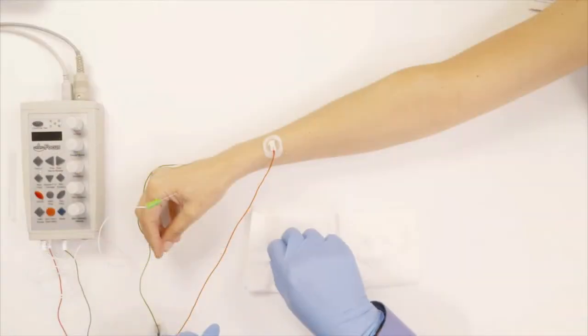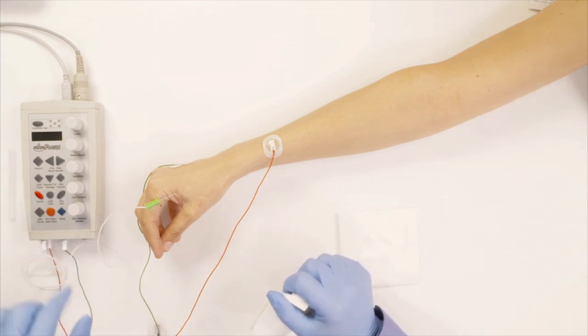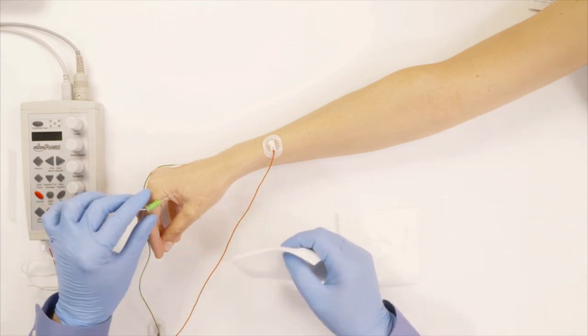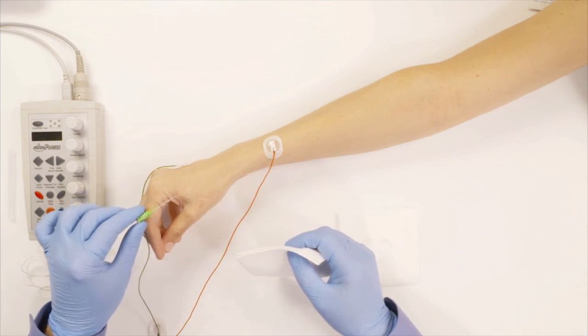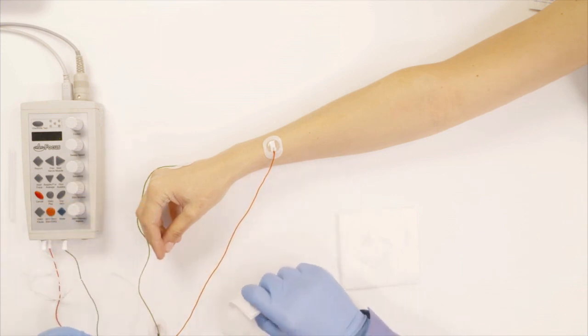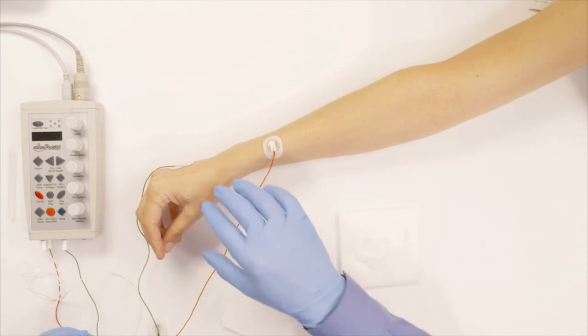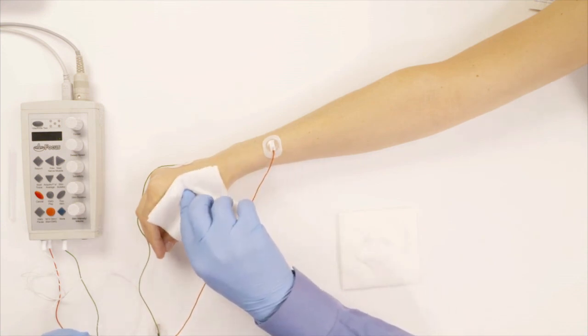So now I will take the needle out. And it's very important at that point that when you're taking the needle out, first of all, I'm going to stop the acquisition. When you're taking the needle out, watch for bleeding. I'm taking the needle out like that. And I'm watching to see if she's bleeding. And in fact, she's not bleeding. But if she is bleeding, what I'll do is I'll press on that. And I press on it for about 30 seconds to stop the bleeding before going to the next muscle.